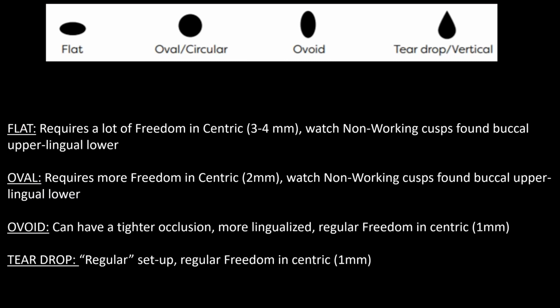So the chew cycle then influences how the teeth function. And so depending on what I see and determine from the patient will be dependent on how much wiggle room I give them and how much clearance I give them in freedom in centric, so that the cusps don't hit and slide into position.